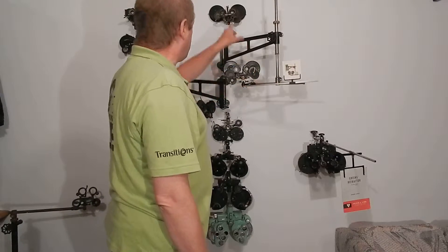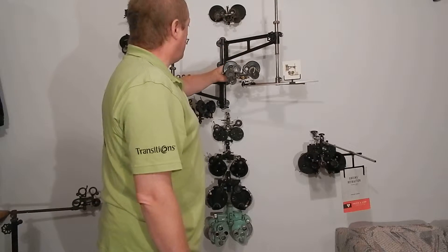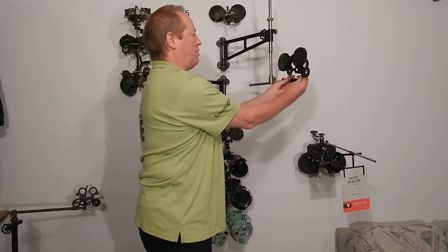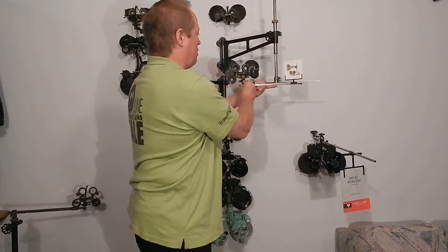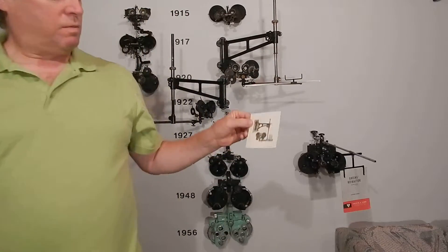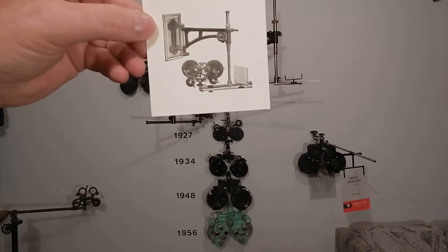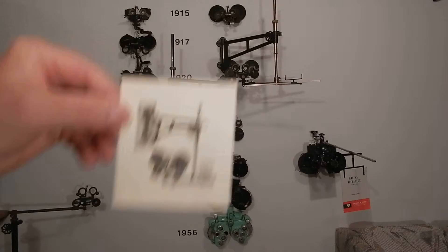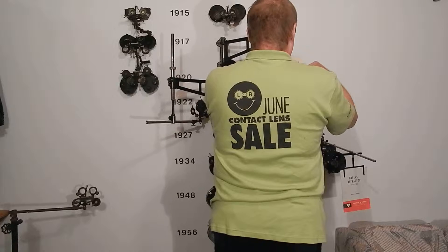It's exactly the same as that one. It doesn't have a forehead rest — it's got rubber eye guards instead. This wall mount is taken from the book that shows the 570 with a wall mount.